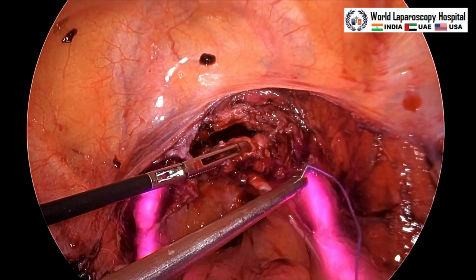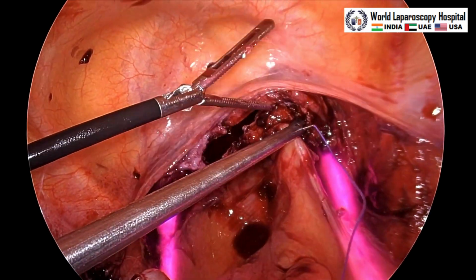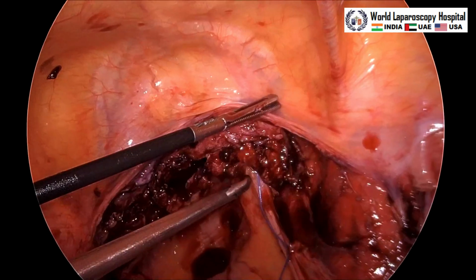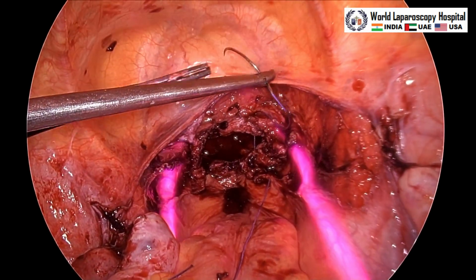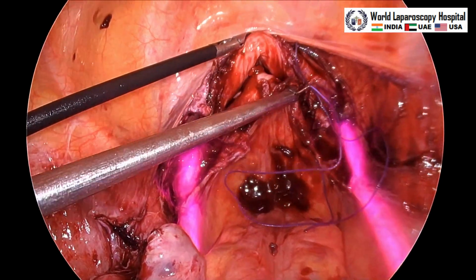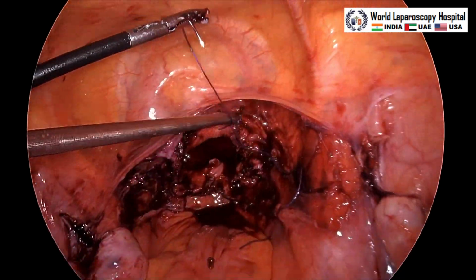Now this is the uterosacral ligament. This is the right uterosacral ligament, posterior leaf, and this is anterior, and epithelium, as we know, must be included, and this is the anterior leaf of the vault. So anterior and posterior vagina bite is taken, and then we will do the continuous suturing. So this is 3 bites only, one on the one uterosacral, then another in the middle, and it is a little everting, which is good, so that there will be no granulation tissue formation.